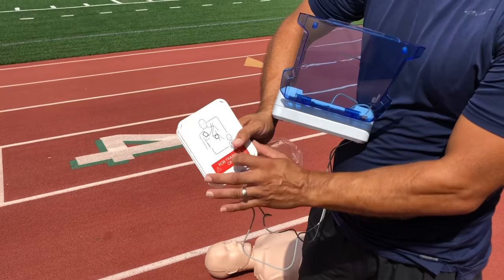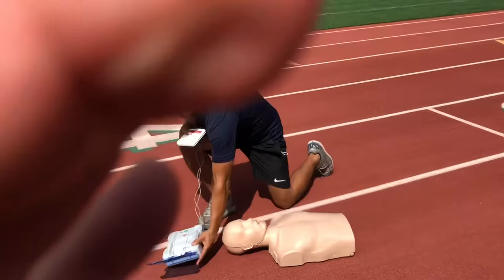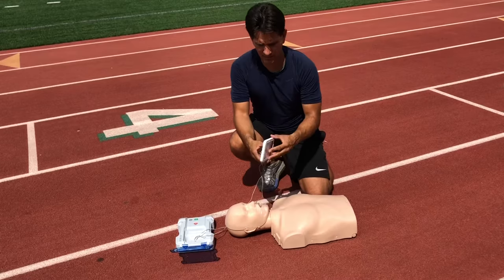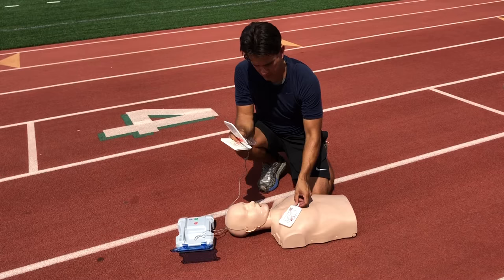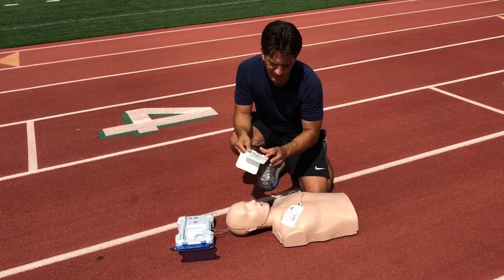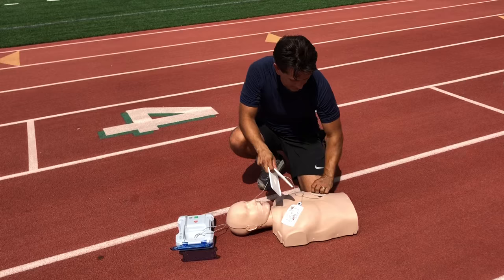The AED will prompt you: open packet and apply pads on the patient's bare skin. Press the pads firmly on the skin as shown in the pictures. If the pads are not placed correctly on the patient, it won't advance to the next step. Once pads are secured, the AED will begin analyzing heart rhythm — do not touch the patient.